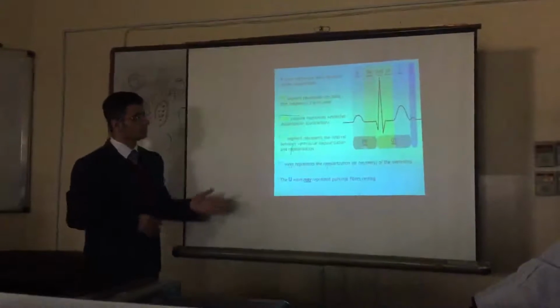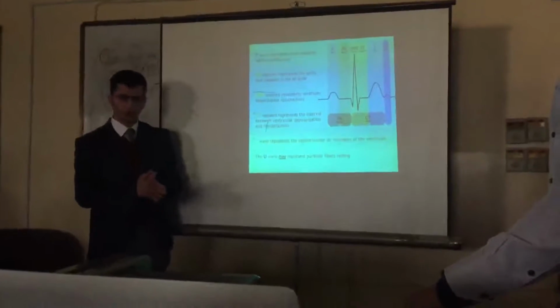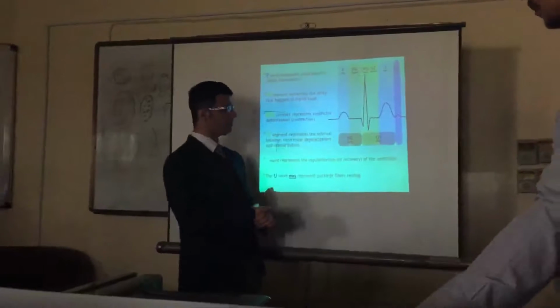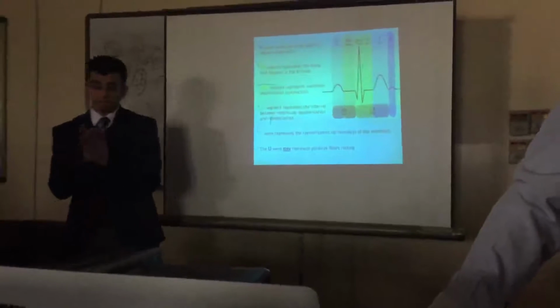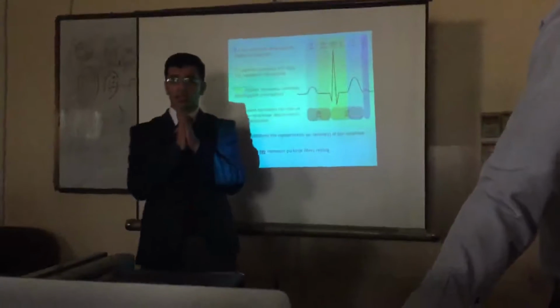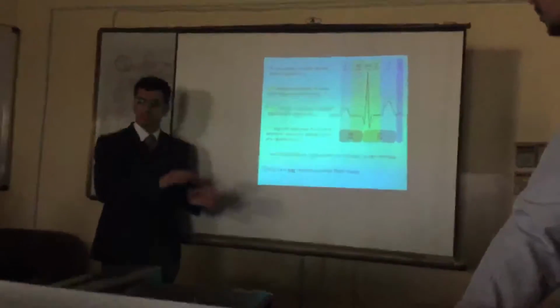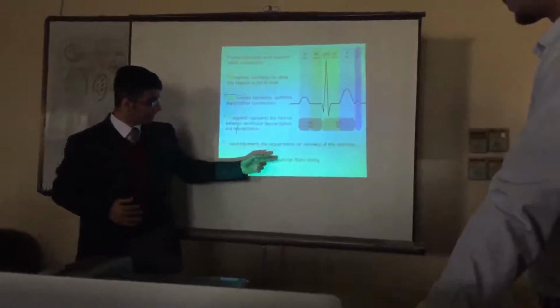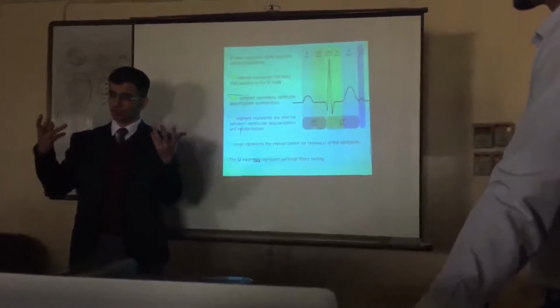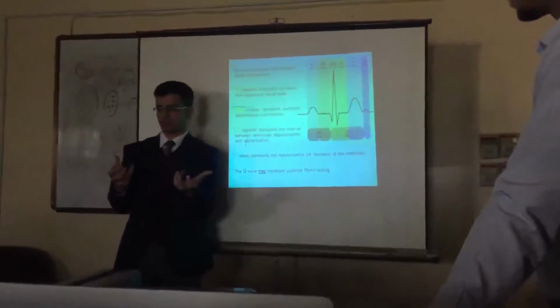I highlighted the U wave here and underlined it for one reason, which is that many theories have been suggested for the U wave. The U wave appears at 65 beats per minute or less. If your heart rate is 70, it's not going to appear. Only if it's 65 beats per minute or less. Then it represents the Purkinje fibers, the ones that contract the ventricles, the Purkinje fibers resting.